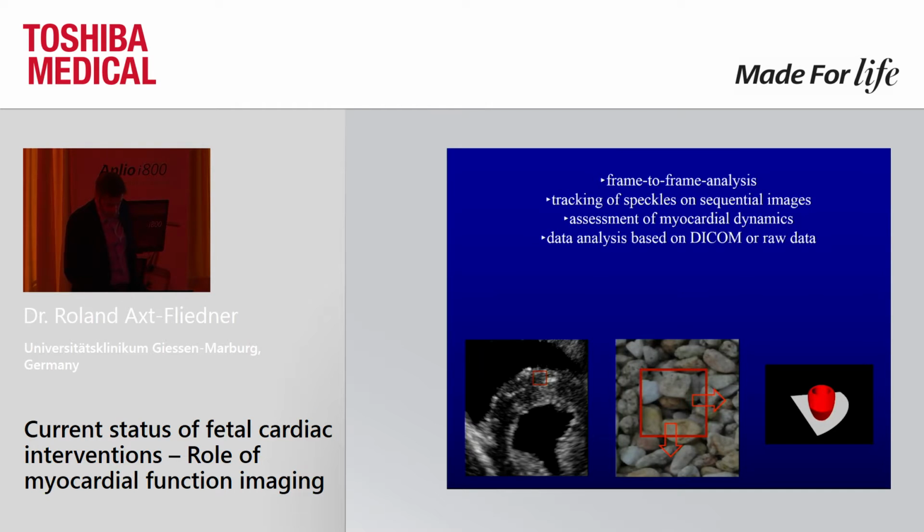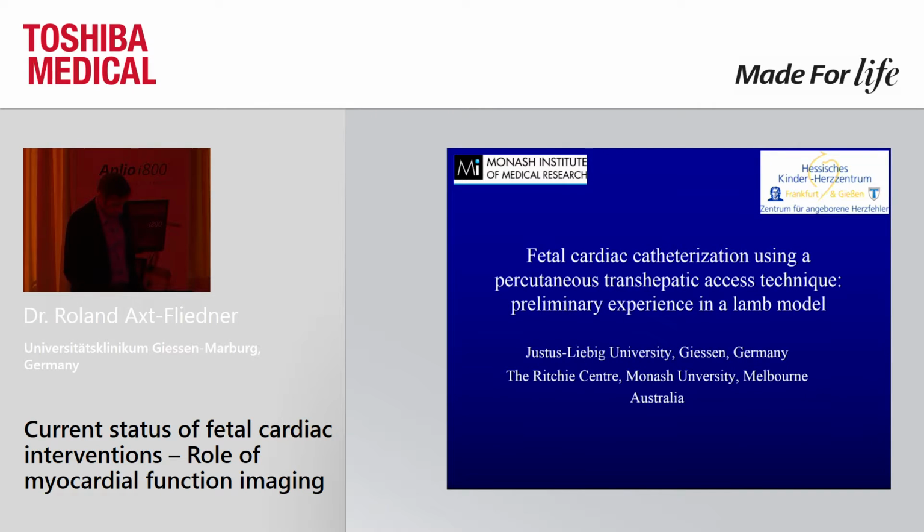And Christian showed that, this is discussed also in the community, whether this relies on high frame rate acquisition, and he did an analysis of the frame rates by DICOM of 30 and 60, and there were no major significant differences using 30 or 60 frame rates by DICOM. And there's another study going on using acoustic frame rates, and we will have this information in due time.